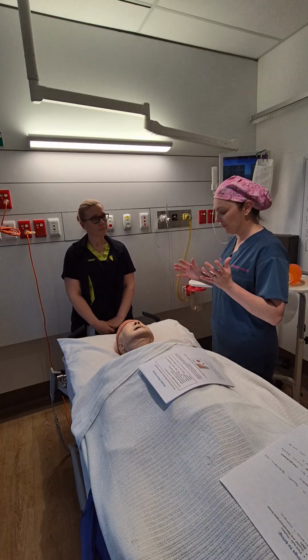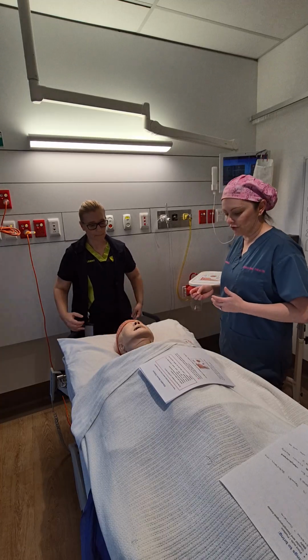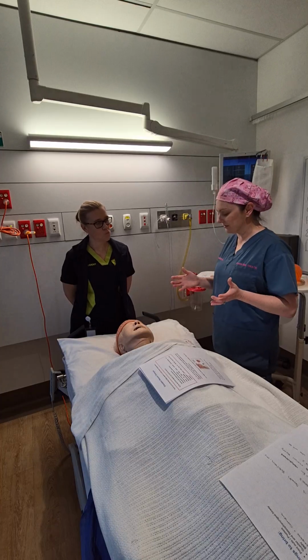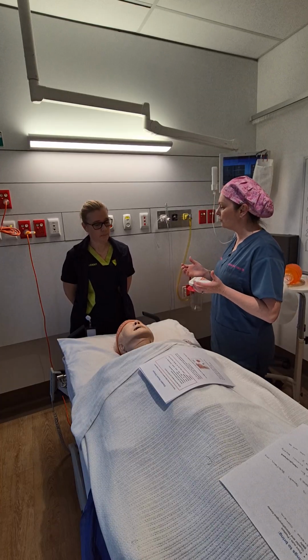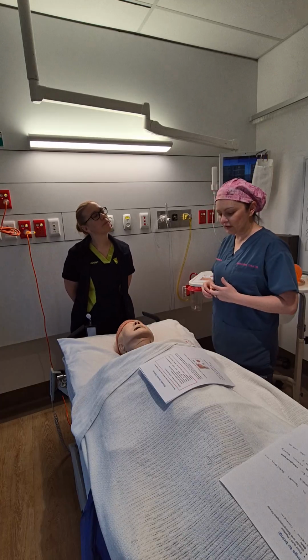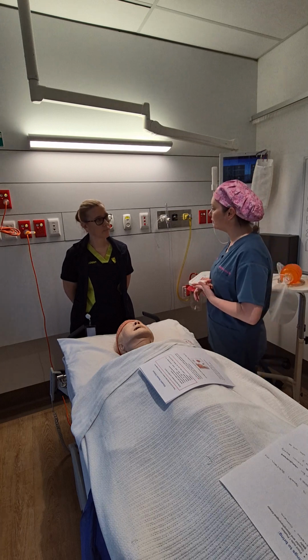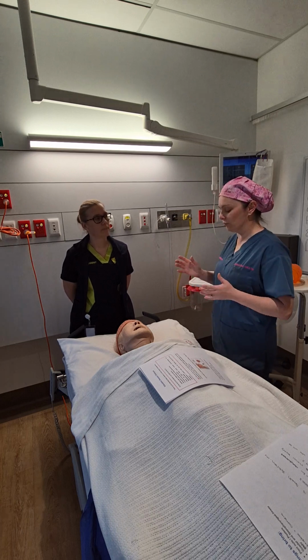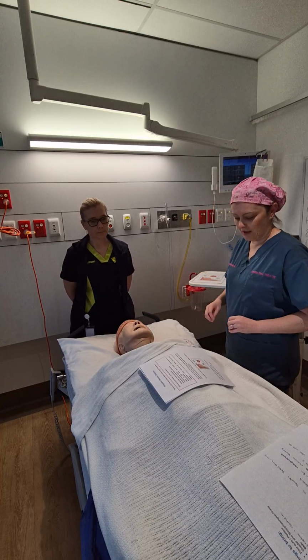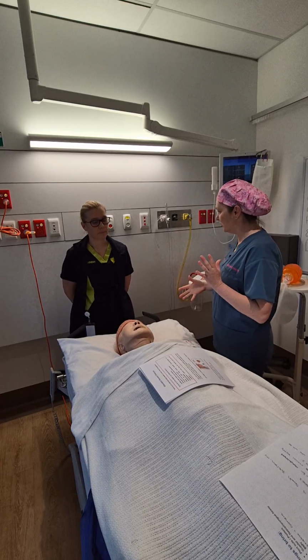So just a quick overview of what we're going to learn today. We're going to go over some airway anatomy, and then we'll go through some common airway obstructions. We're going to practice and provide adequate jaw support. Then we'll go for selecting and inserting basic airway adjuncts such as oropharyngeals and nasopharyngeals, and then we'll go on to effective bag mask ventilation.